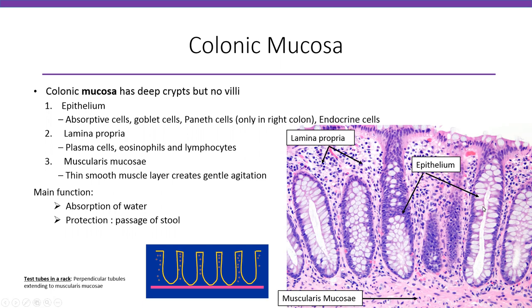The epithelium consists of goblet cells — notice all these mucin-filled cells with the nucleus at the base — as well as absorptive cells, which are the pink cells in between. You also have Paneth cells and neuroendocrine cells present in the colonic epithelium.